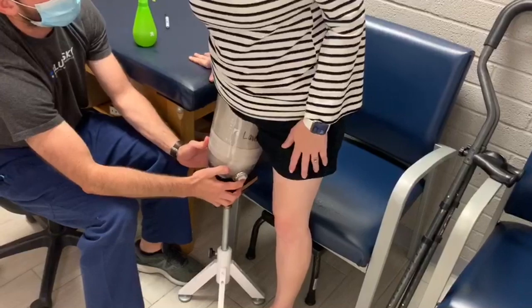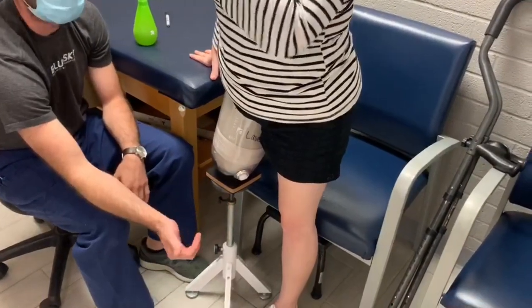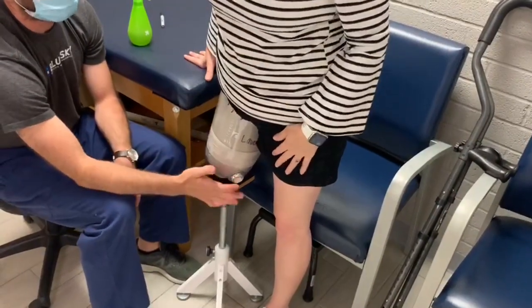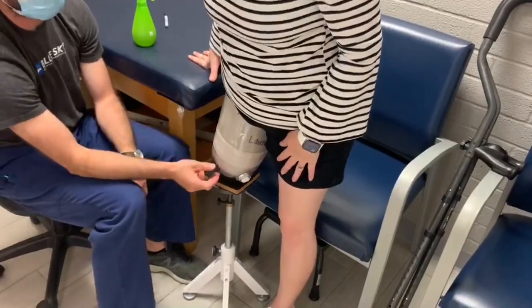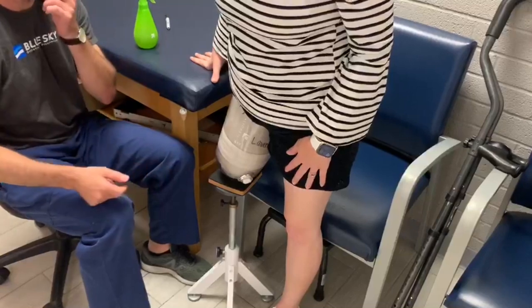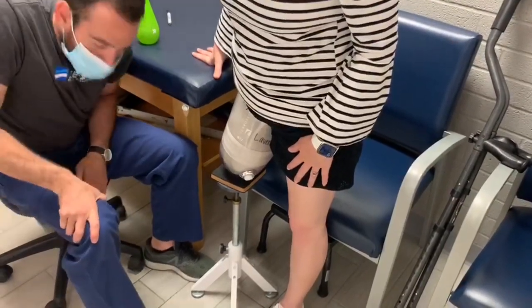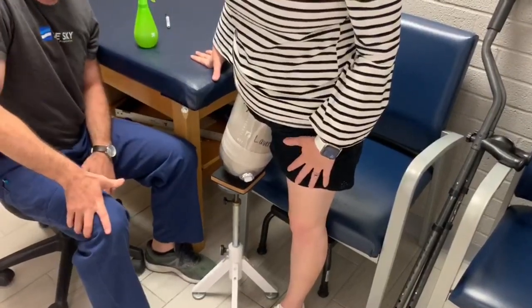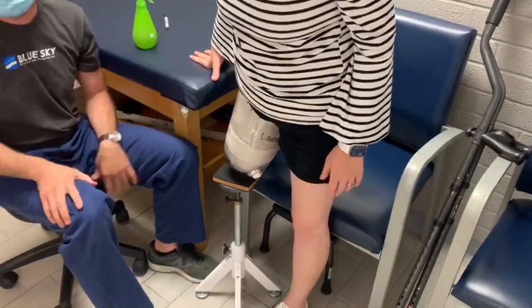Now I'm pushing this button. When I push this button, that opens the port. It will allow air in and out. You can push air out of it without pushing the button if you push down hard enough, so you could just get it on and walk, and it'll do it. Or if you're having a swollen day, sometimes you have to hold that button and push. But after you push down, you have to let go, because when you come back up, that'll allow air in. So you just have to make sure you let go of the button. Makes total sense.